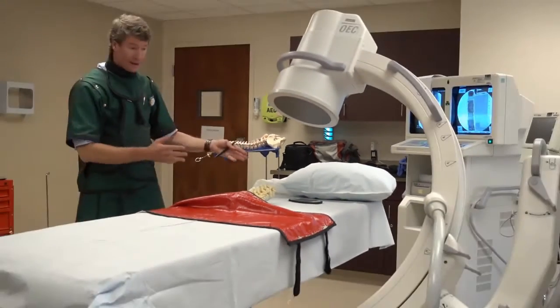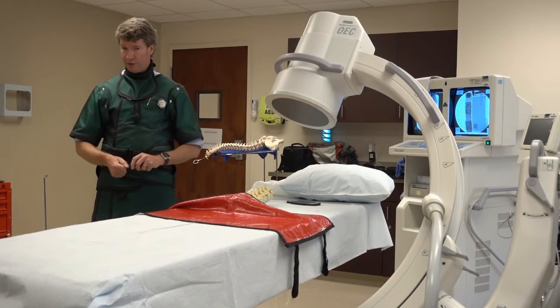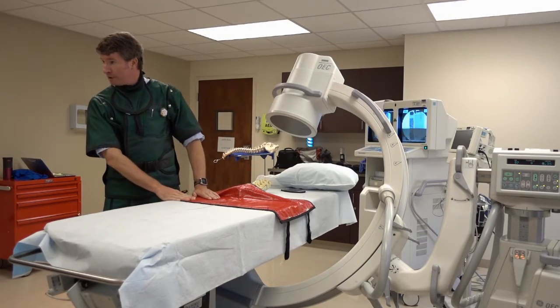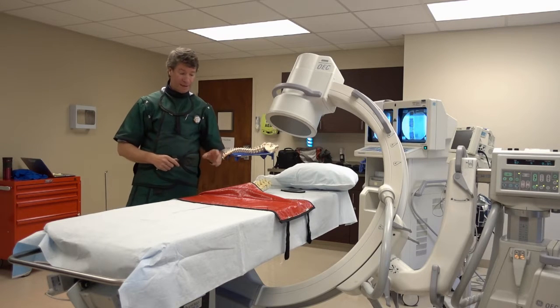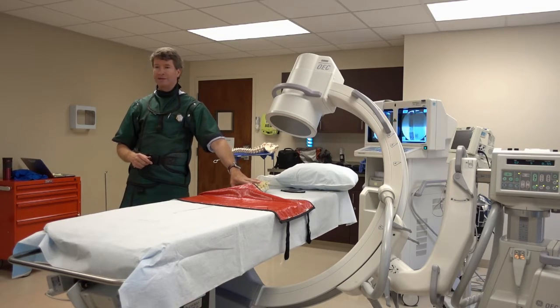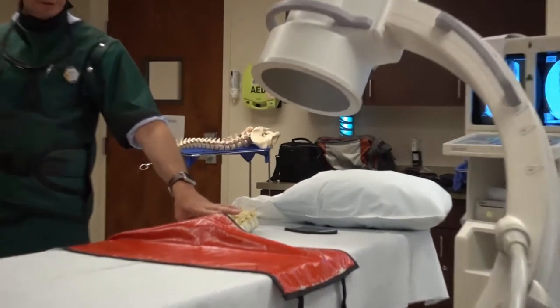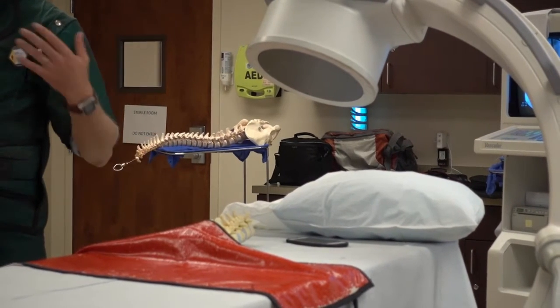And even more so in the neck or in procedures where you may use the fluoro a lot, like in spinal cord stimulation, where it may take a little bit of time as you're driving that lead up, you're going to use more fluoro. So all the more reason. This also protects the staff quite a bit. Because, again, just imagine it like light. You have a drape, less light coming through. The one thing it does do is it does expose the patient a little extra. But since they're in this procedure just for a few seconds, versus days for us or even years, the little bit of increase that they get is not much, but it's a massive thing for us.